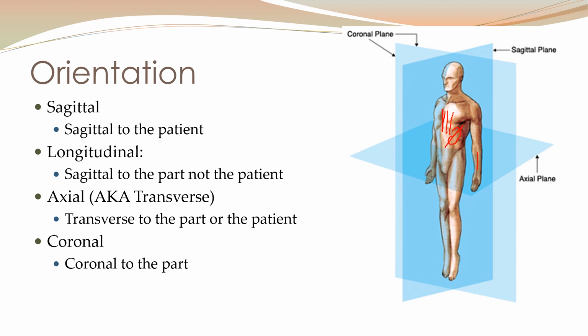Now, with everything that we look at with ultrasound, if we see something in the long plane and then we turn and it disappears, that probably means that it's artifactual. So if I found something in the kidney when I was scanning in the long axis, then turned 90 degrees and scanned through that kidney and could never find it again, it probably indicates there was some kind of artifact. So in ultrasound, we really want to orient ourselves to the anatomy in two planes that are 90 degrees to one another to ensure that what we're seeing is accurate.